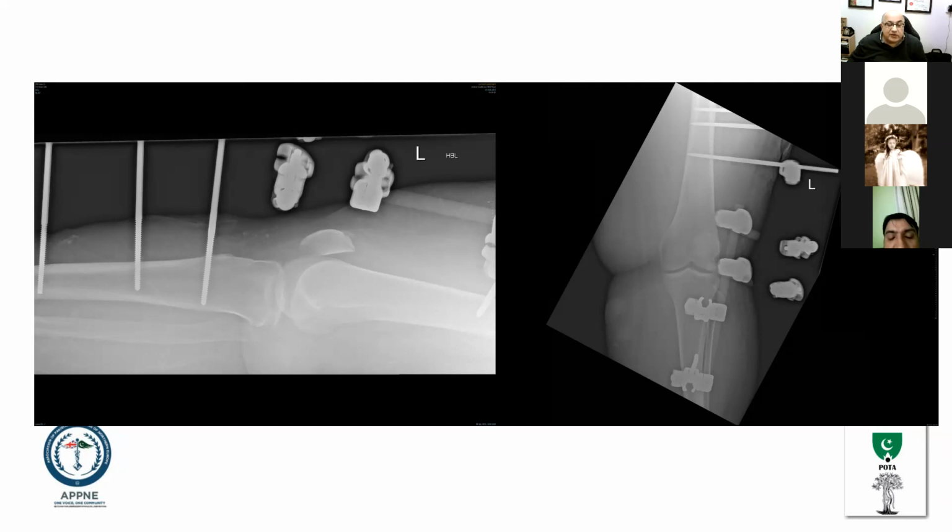But we wanted to do the vascular bit first. The vascular surgeon came in and looked at it and said that there is a tiny intimal tear, it doesn't need surgical correction, so you can do what you want to do. So that's what we did. We then did an MRI scan of this patient.